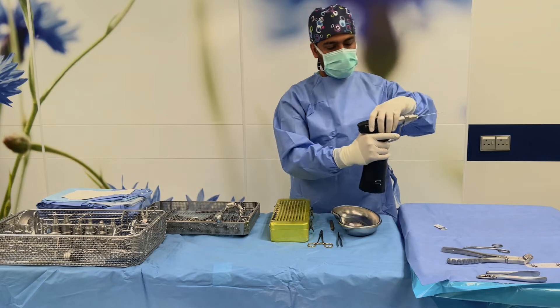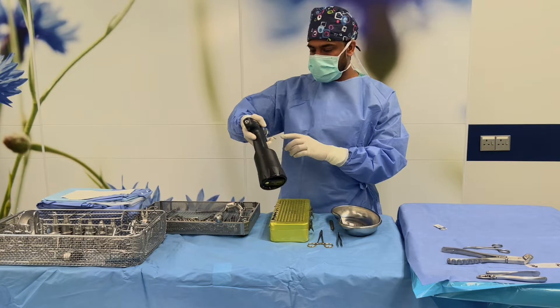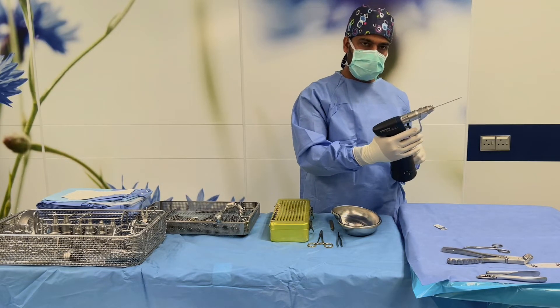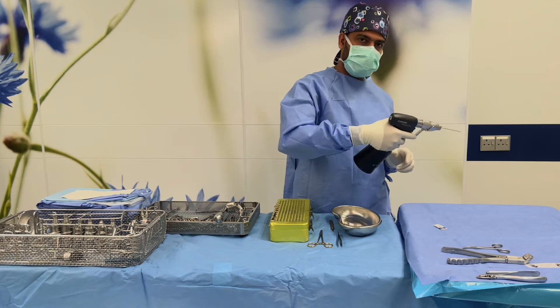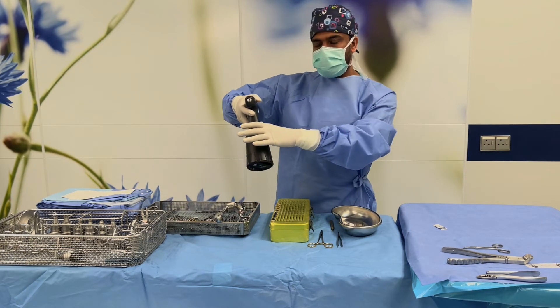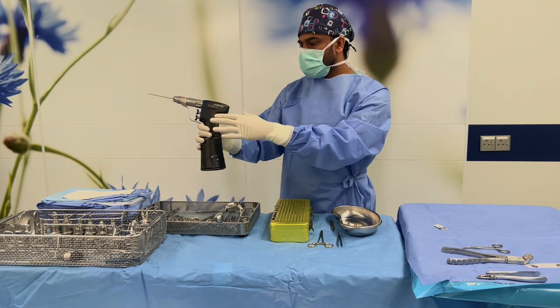When you handle this K-wire, be careful — it is sharp. When you handle it, you need to use tape. After you connect the K-wire and put in the battery, check that it's working. When you check it, don't point it at anyone — point it down and check. Also, when handing it to the surgeon, hold it like this so the surgeon can receive it easily.